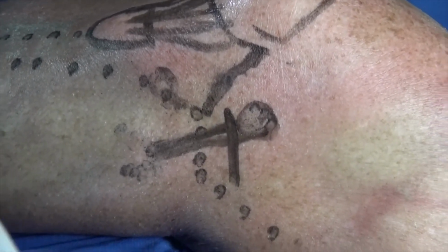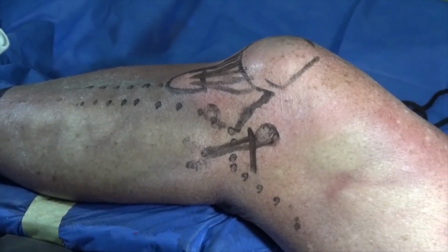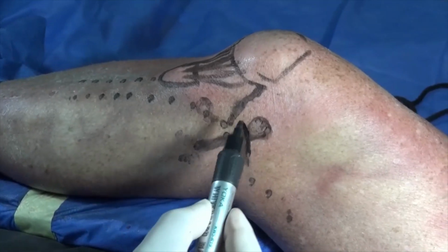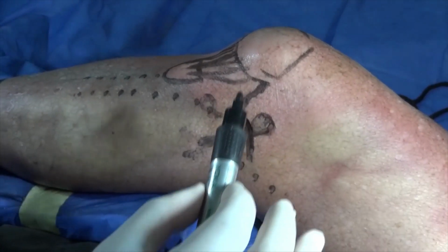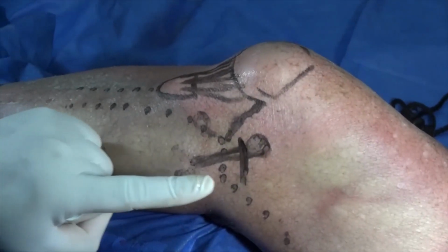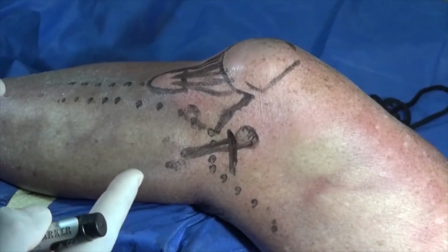What you cannot see and what you cannot feel is another very important structure, which is the popliteus tendon, which I have marked here. So that part, how to identify it, how to clear it, and how to put a rim plate without damaging these two vital structures is the second part of this dissection.